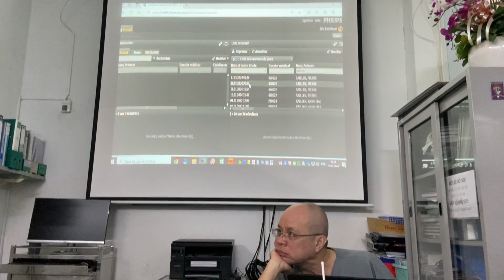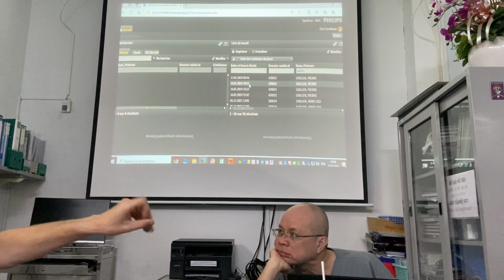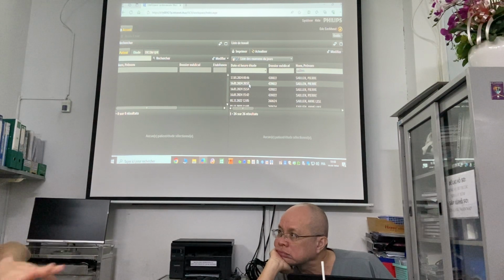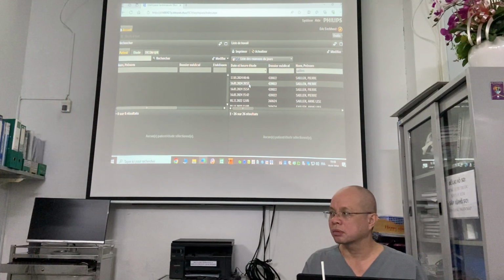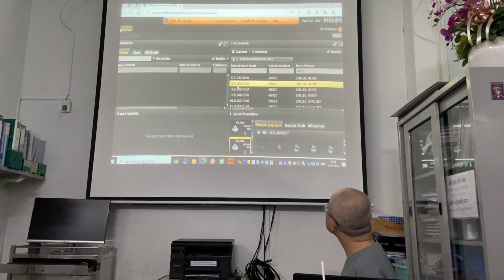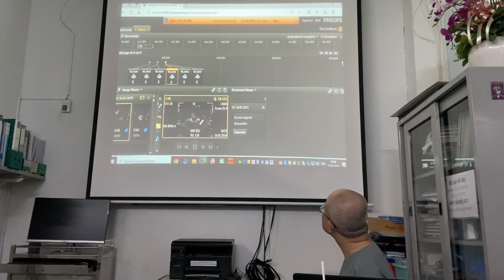And I have to mobilize the drain 3 times, because when I do the echo, there is a lot of adherence and some fibrin inside the pericardium. And finally I stop. There is almost no more pericardial effusion. I send the patient to the ward, and that's it. And then, look at this. I think you've never seen this before.